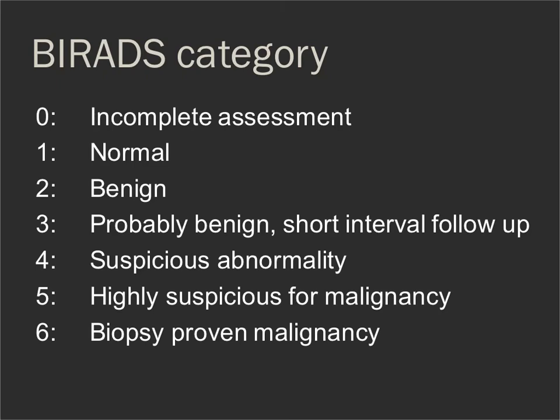And then, as I said, similar to mammography, you need to come up with a final BI-RADS category, 0 to 6, and you need to decide what management is appropriate for this patient. This might be follow-up, it might be going on to have a callback ultrasound, it might be surgical treatment, and so on.